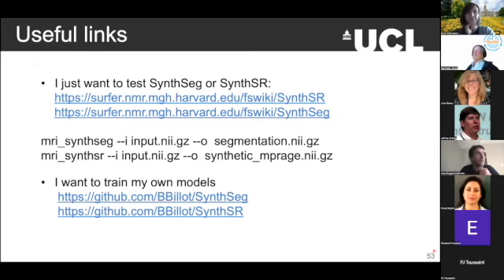And I think, complete speculation, that if during training, when you feed images without lesions, you heavily penalize segmenting lesions anywhere, you could fix that. Because if you use these dice scores during training, what happens is that if you have no lesions at all, the dice is 0, no matter what you do. If you put a lot of lesions in the white matter, the dice of the white matter will go down, but that's not such a big price to pay.